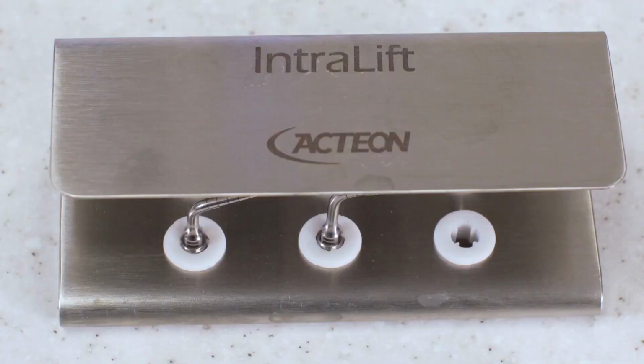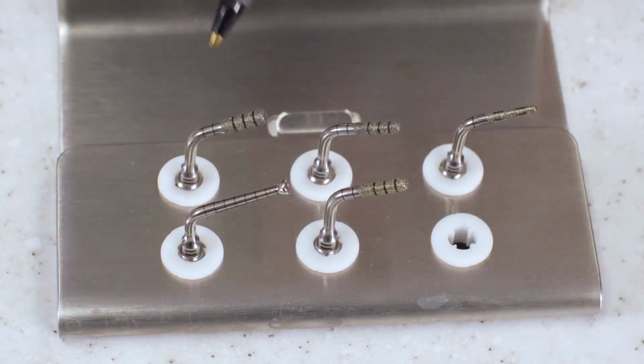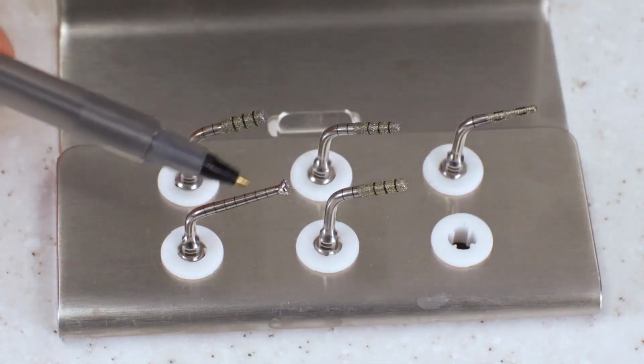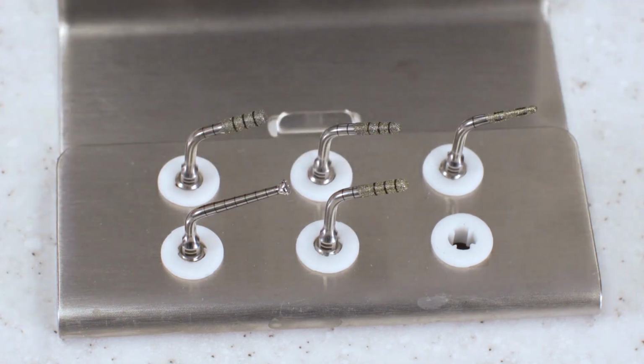Here we have the intralift kit, which is more of a crestal sinus approach. And on here we have diamond coated burrs so that we can cut through the bone without cutting the membrane. And then we have one for accessing and lifting the membrane, which shoots water up. On all of these you have 2 millimeter line markers so that you know your depth on that.